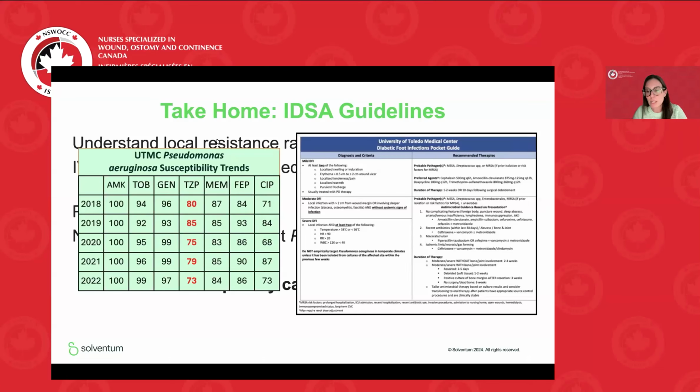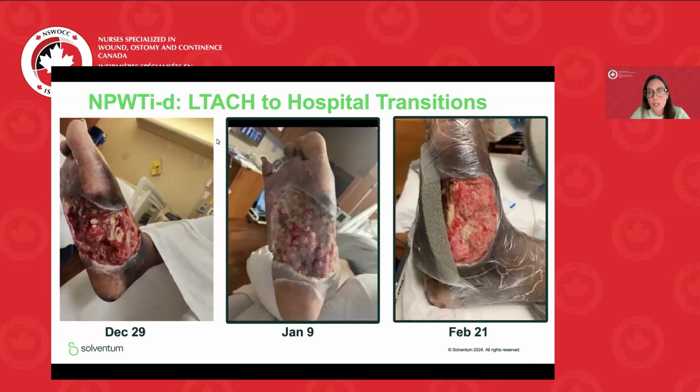This is a patient that we used the instill and dwell on initially, again because of his diabetes and his concurrent PAD. We suspected that he was going to renecrose. After we got that infection initially controlled, we didn't want to have to keep taking him back to surgery. So thankfully, once we did the angiogram and that last washout, he did not need any more operative debridement. So you can see the progression of the negative pressure instill.